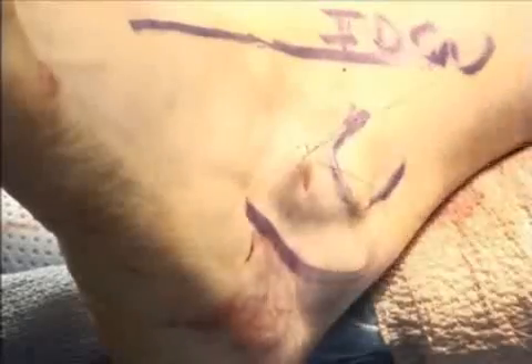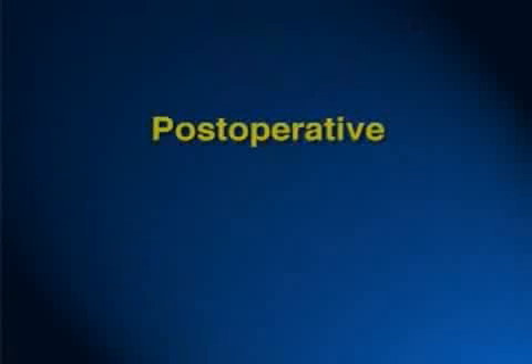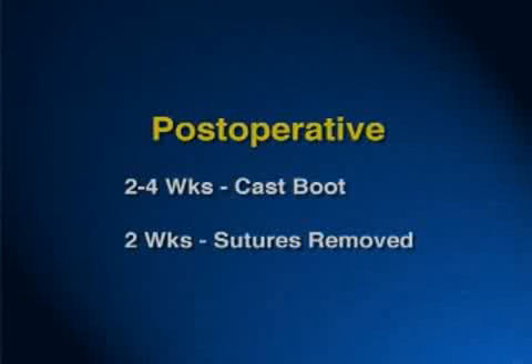The skin is closed with two horizontal mattress sutures. If you're performing additional procedures, those can certainly be performed and would dictate the post-operative care. Otherwise, if just the Pro-Stop procedure is being performed, the patient is placed in a below-knee cast boot generally between 2 and 4 weeks. Sutures are removed at 2 weeks.